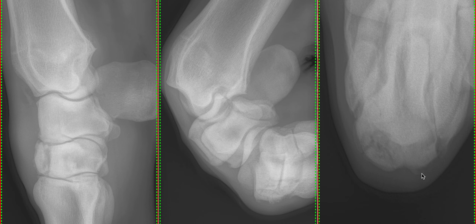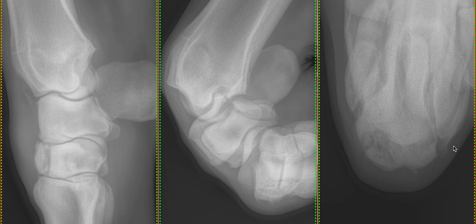If we look at the lateral portion of the third carpal bone, or the intermediate facet, we can see that's actually quite dense in appearance — quite white — and we would call that sclerotic. We've also got some periarticular new bone just here, and also at the junction of the third and fourth carpal bone. So we've got a reasonable amount of periarticular new bone formation associated with this fracture.